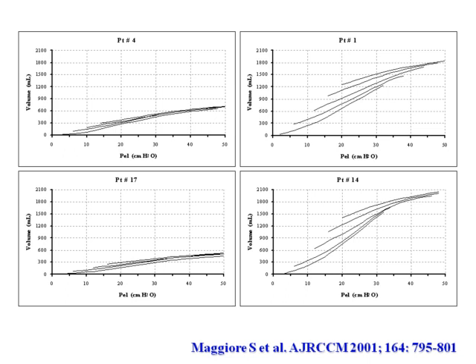Now some ventilators allow us to measure recruitment. And this is important because we discovered that there are two different types of patients, very important probably for setting PEEP in that condition. This is a nice study from Salvatore Maggiore and the group of Laurent Brochard, that shows two types of patients. This is a patient in whom PEEP does not produce any recruitment.